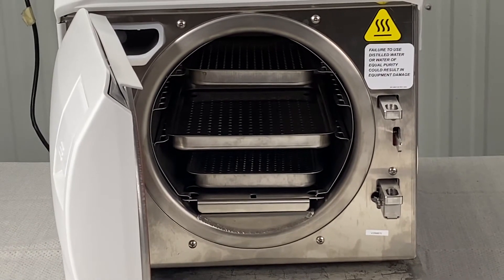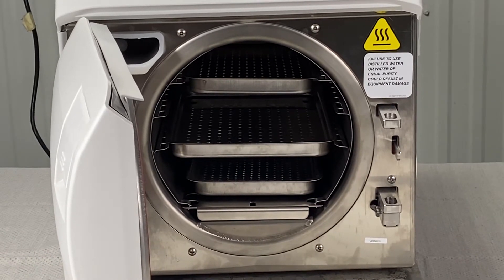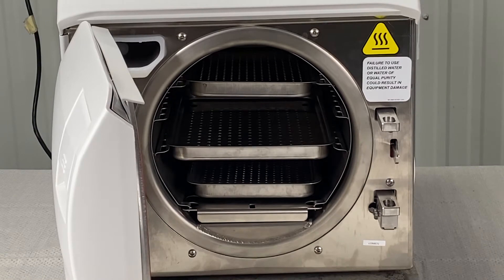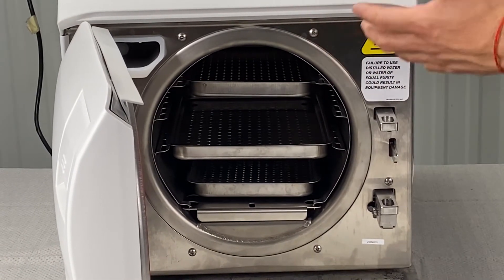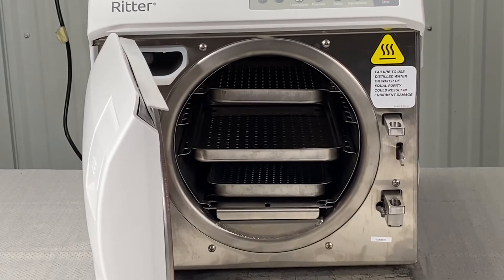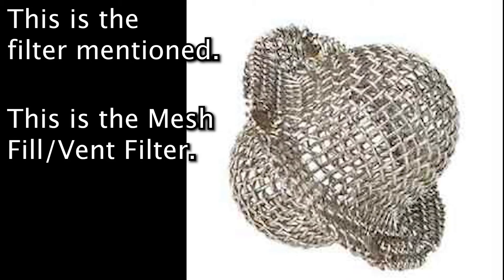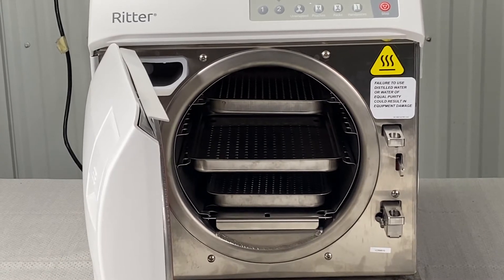Basically, this is an overheat error — it's losing pressure somewhere or not getting water somehow. You'll pull everything out and look at the filter inside the chamber, right inside where the heating element is, and make sure that's clean. Refer to the weekly and monthly maintenance for that.